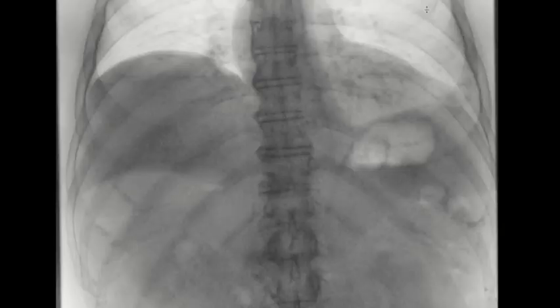Here we have a diaphragmatic sniff test, which is done to evaluate for diaphragmatic paralysis. Normally when we inhale, both hemidiaphragms come down, and as we exhale, both hemidiaphragms rise. When we inhale, the hemidiaphragms come down.